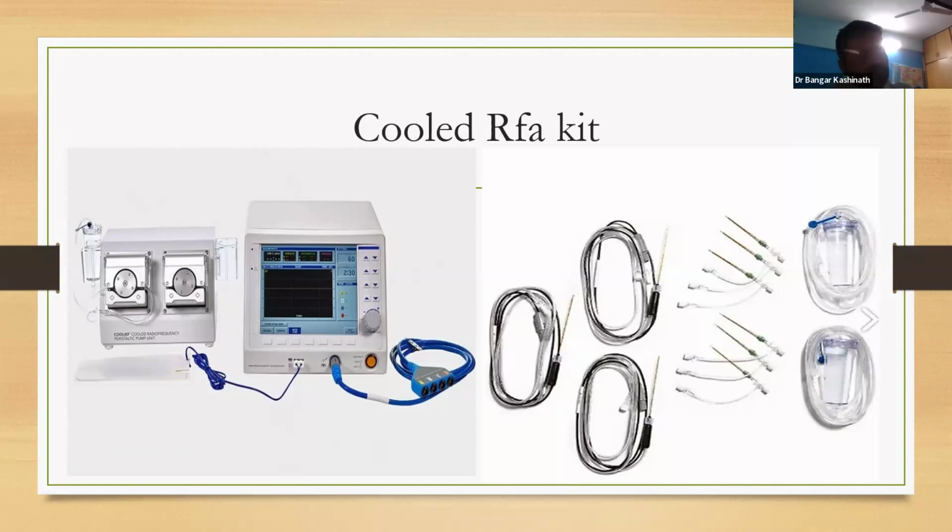You are partially correct. Sir, whenever there is an increase in the temperature, there will be adjustment with the voltage inside the machine in conventional. So the temperature is controlled. It is set according to whatever we set in the machine. So that temperature is limited. So in conventional, whatever temperature we set in a machine will be delivered, correct? Yes, sir. So how is it related to the size of the lesion?